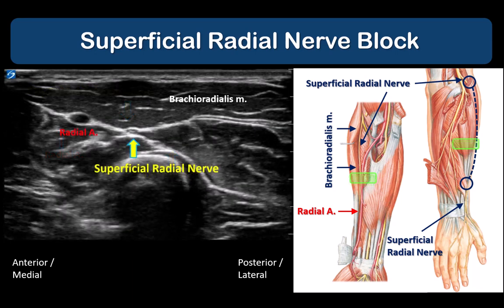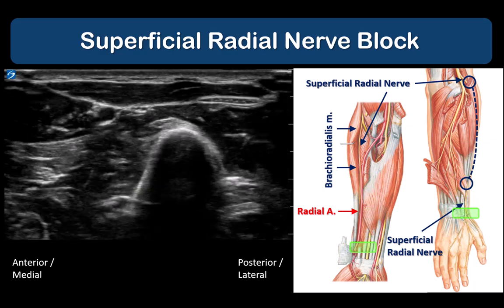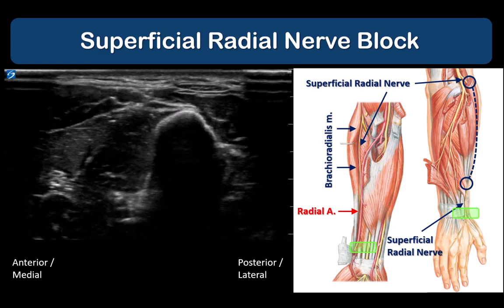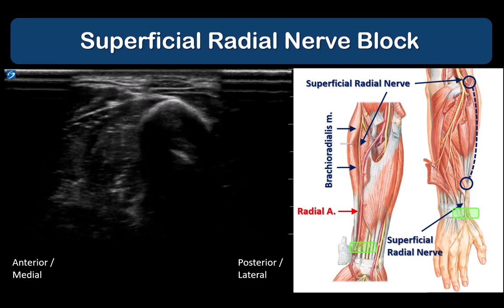As we slide the probe distally towards the wrist, the brachioradialis muscle shrinks into its tendon and the superficial radial nerve continues to lie under the muscle but becomes more and more superficial, running just lateral to the radial artery until it lies just under the same investing fascia.